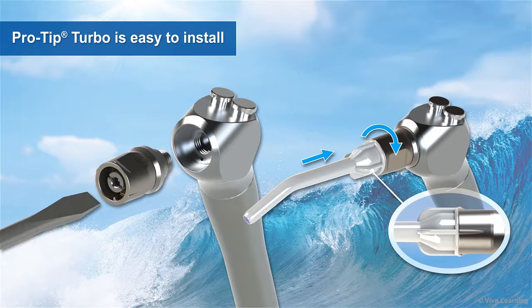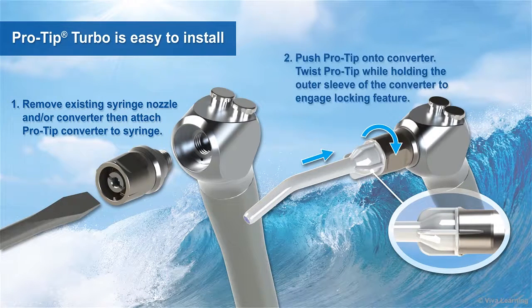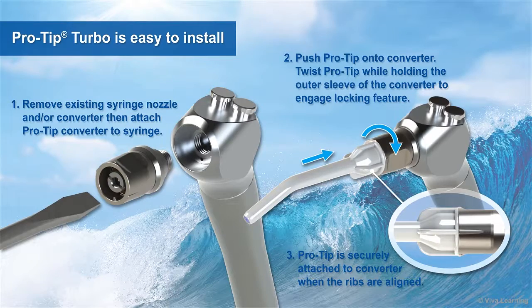Regardless of which converter you choose, installation is easy. First, remove the existing syringe nozzle and or converter. Next, install the chosen converter using a standard screwdriver. Finally, push the ProTip onto the converter, then twist it while holding the outer sleeve of the converter to engage the locking feature. When the ribs are aligned, you know that your syringe tip is securely attached to the converter.